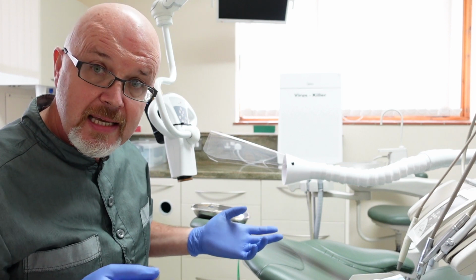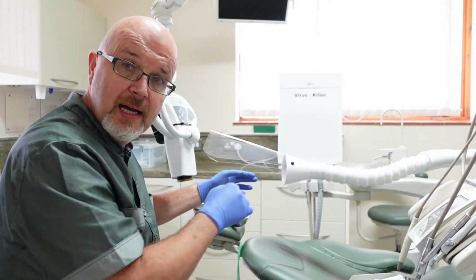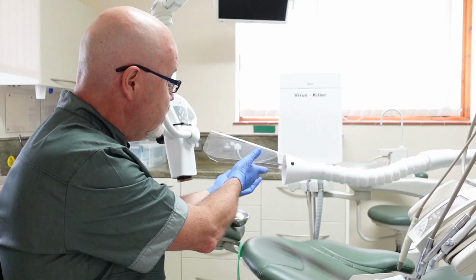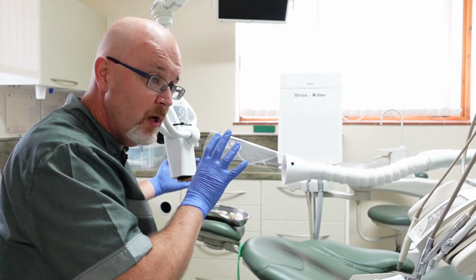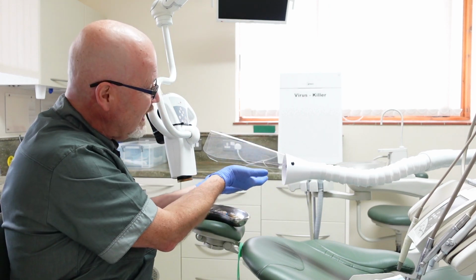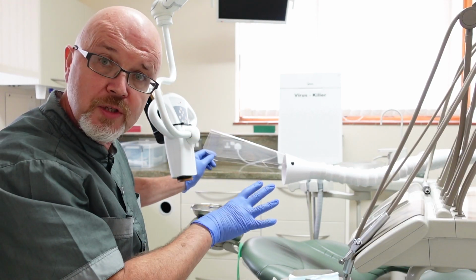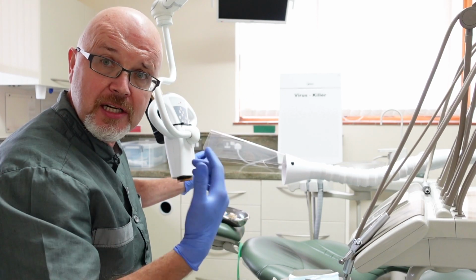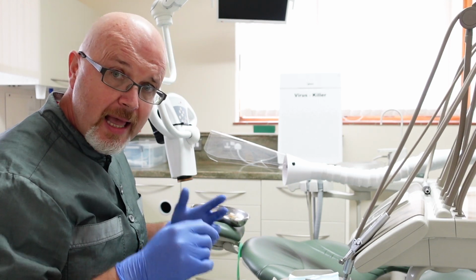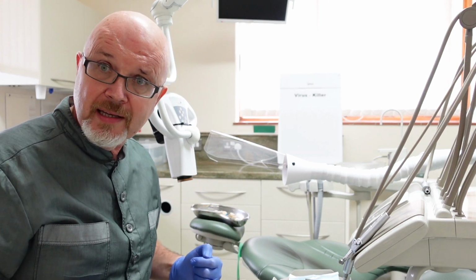So what we want to do is see how long aerosol takes to settle when we've got this in place. Of course, as Susie proved with the vape smoke, you can push the aerosol past the shield, but it's sucking in at a huge rate. I saw one video where the smoke came out the side here and then curled back in and went up the sucker. So impressive. I tend to leave this running on low all the time, because that's filtering the air and purifying it. So I'm getting very low particulate readings in the room anyway, much lower than without any mitigating features. So I'll get kitted up and let's get on with taking some readings.